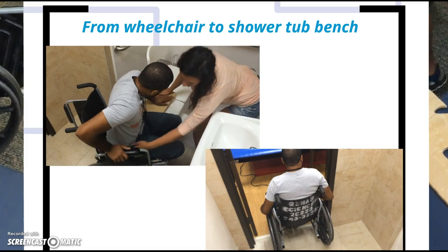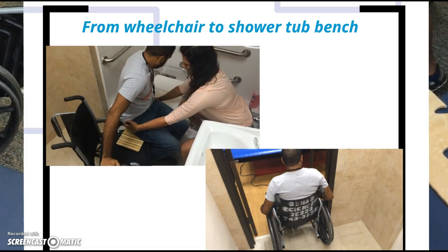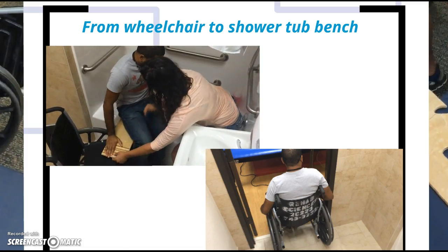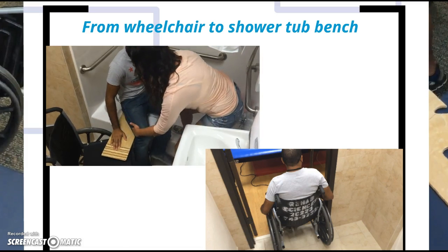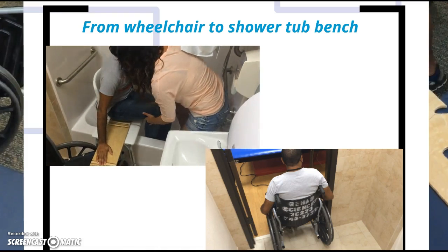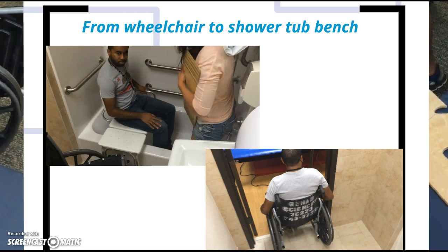Feel good? You can see in this video that Jordan is helping me a lot, but we also need to keep in mind that not all patients will be this easy. You're in a shower.